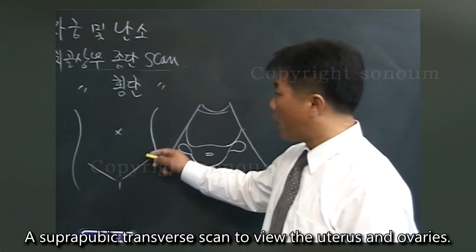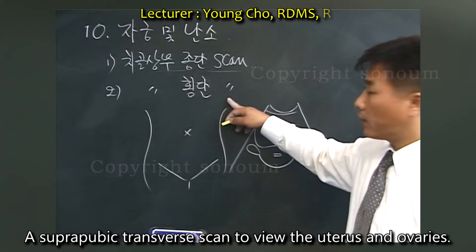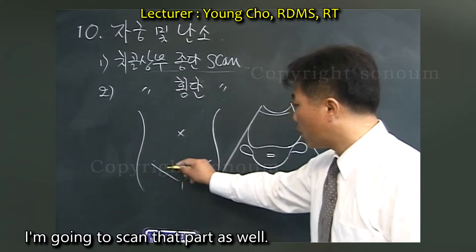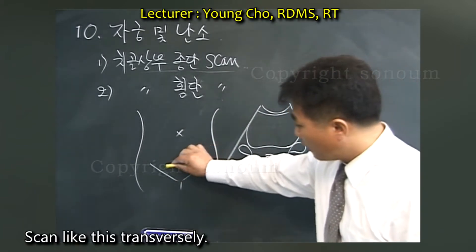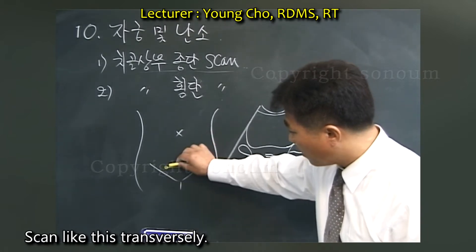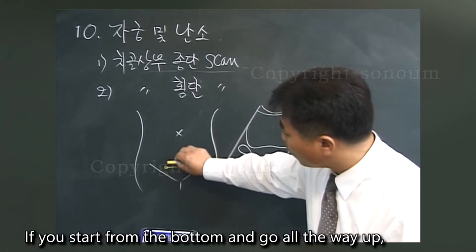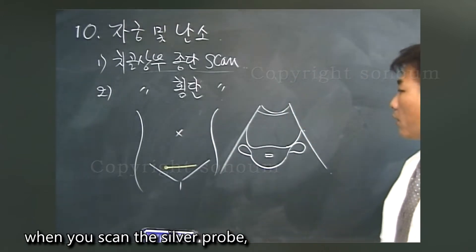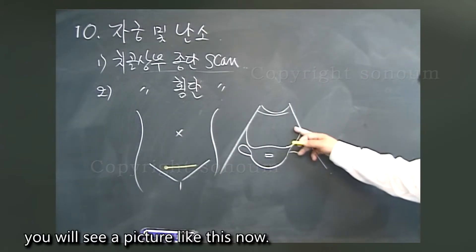A suprapubic transverse scan to view the uterus and ovaries. I'm going to scan that part as well — scan like this transversely. If you start from the bottom and go all the way up when you scan the probe, you will see a picture like this now.